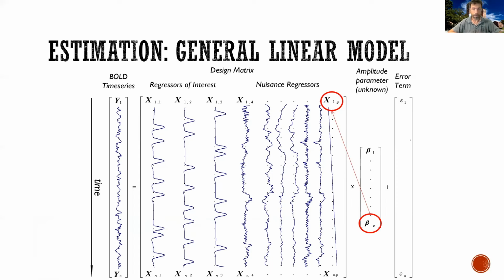So in a sense, you can think of this a bit like baking a cake. We're trying to find how much of each of these ingredients do we need, and in what combination, in order to best predict y. Okay, so essentially that's what the estimation part of this is. We're trying to find out just how much of each of these ingredients do we need in order to approximate y as well as possible. And then, of course, there's an error term.